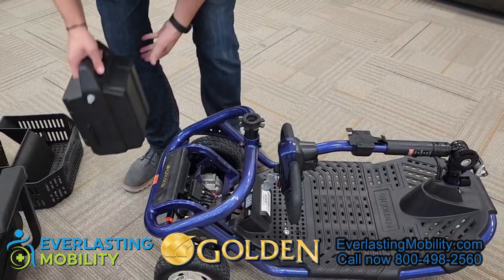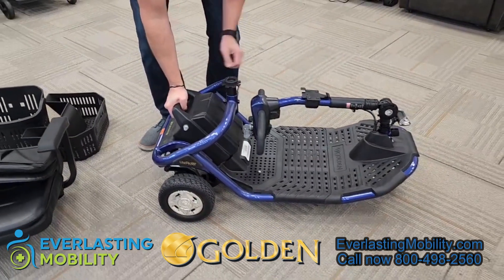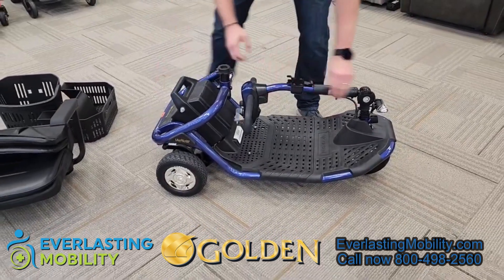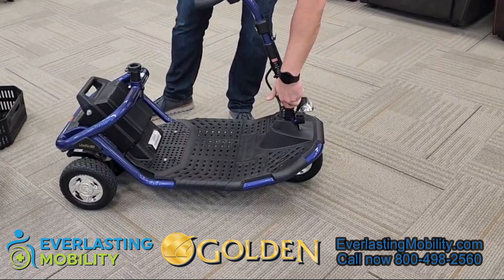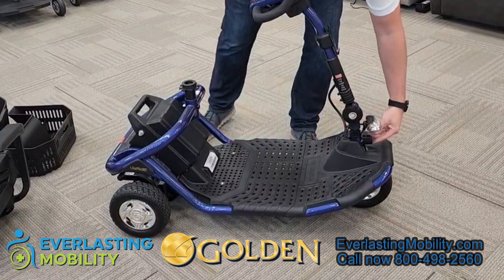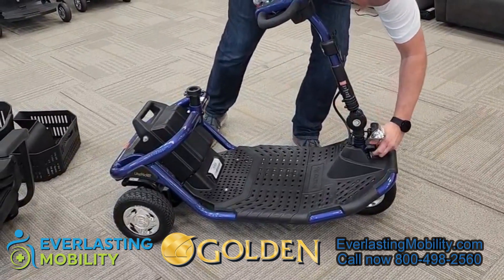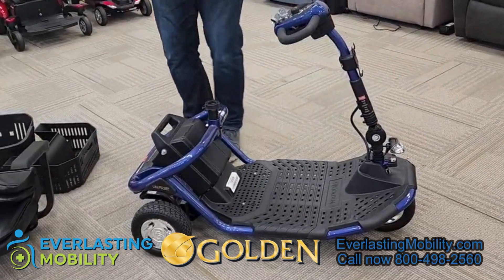Reassembly is equally easy. Make sure the hooks on the front half portion line up with the rear axle and let the hooks drop into place. After that, slide the battery pack back in, then put up the tiller and secure it at a comfortable angle. Make sure you unlock the tiller so you can steer the unit once it's time to start driving.